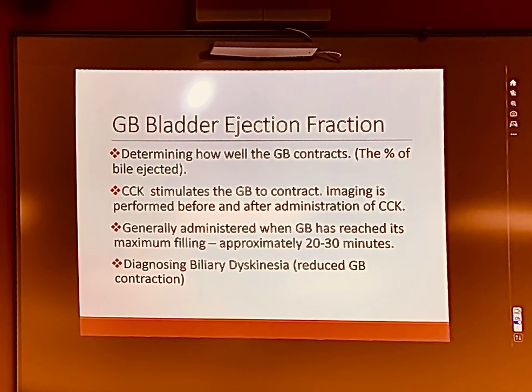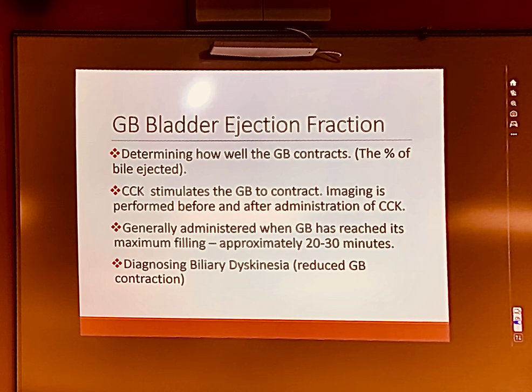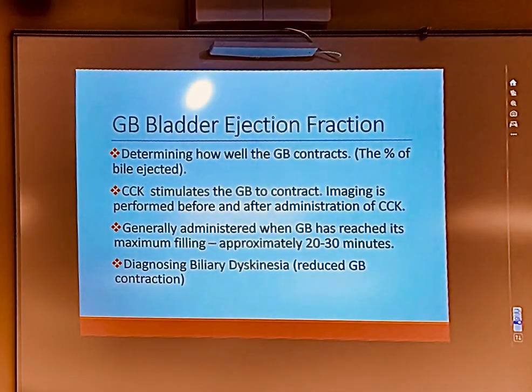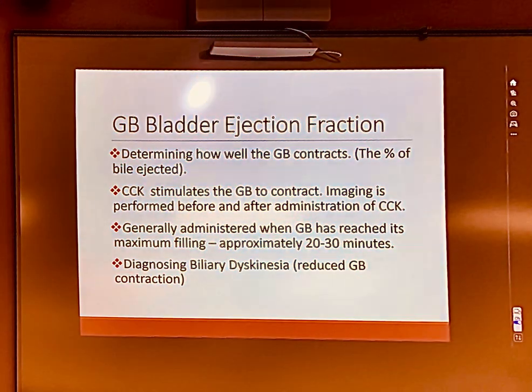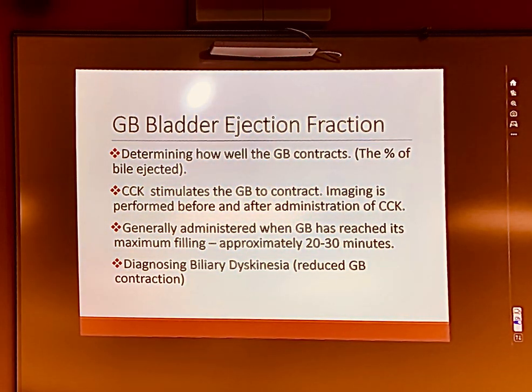The difference is, if your patient has everything at 30 minutes, you have liver, gallbladder, and bowel at 30 minutes, you can call the radiologist and say, hey, I have everything. Can I give the CCK? They're going to say, yeah, okay. Then you start the CCK part. CCK can be done in two different ways. It can be done dynamically or statically.